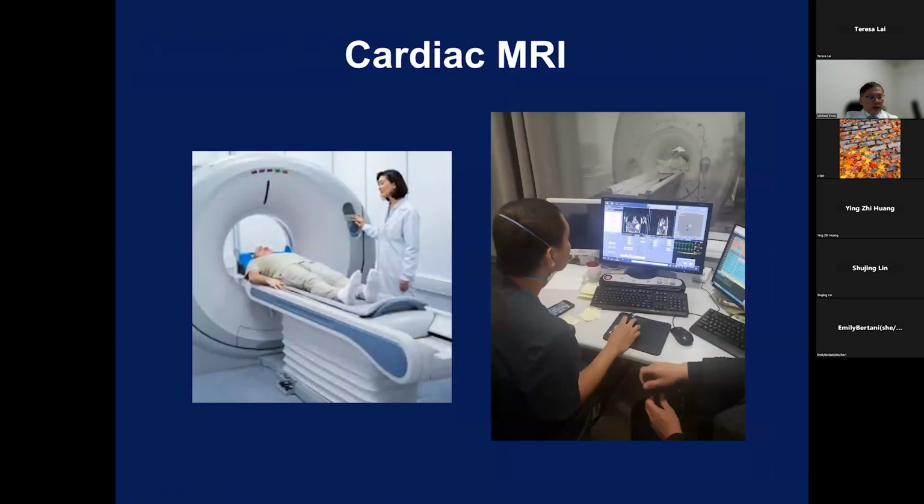So I'm going to switch gears a little bit to talk about MRI, which is another Nobel Prize winner. And this is even harder than CTA. It takes much longer. The physics of MR is very complicated. They generate radio waves and proton spin from the excitation, and then you look at the proton relaxation to see what kind of tissue you are dealing with.